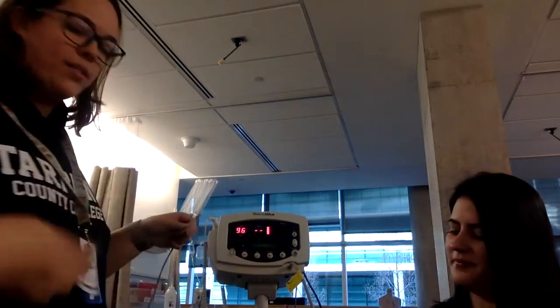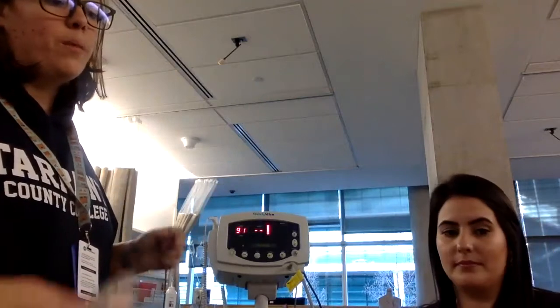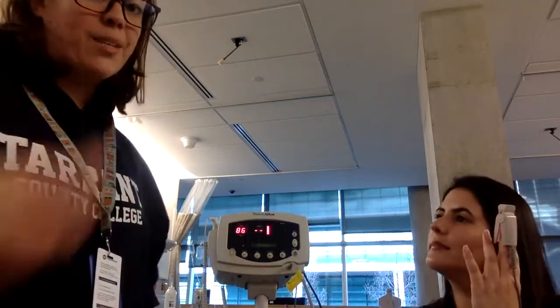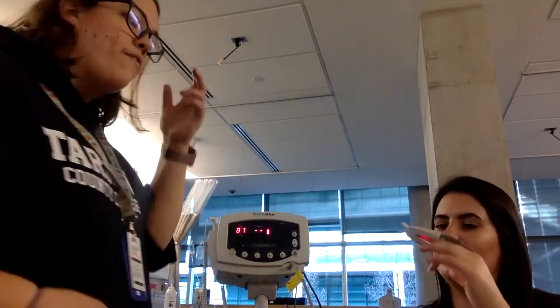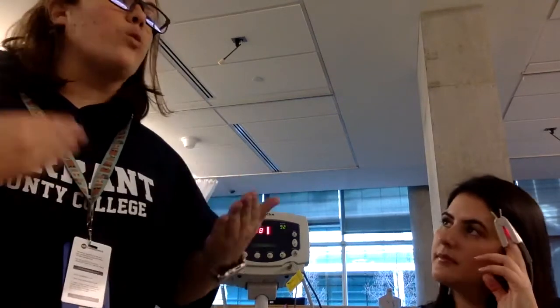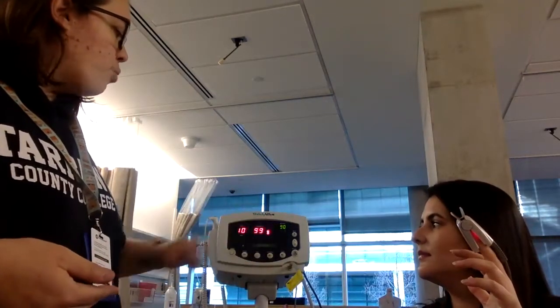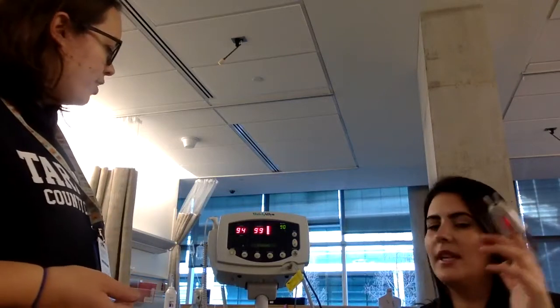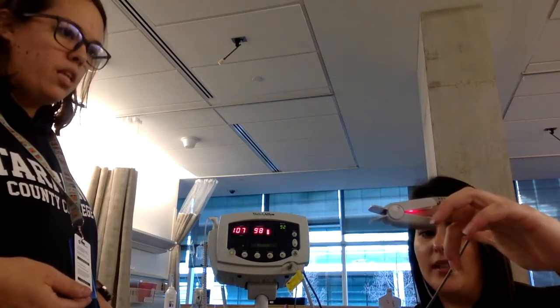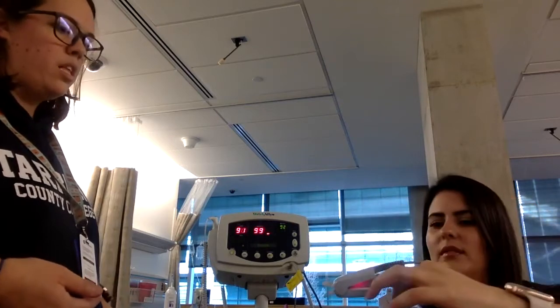While the machine is taking her blood pressure, I can attach the pulse oximeter. I like to put it on the opposite hand from the blood pressure cuff so I get a more accurate reading, since the cuff can decrease the SpO2 reading. I'll put it on a finger — it doesn't matter which finger, but choose one with a shorter or smaller fingernail, especially for a female patient. Make sure the light sensor is on the nail side rather than the bottom of the finger.